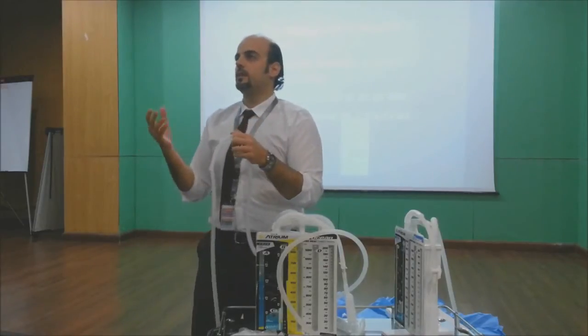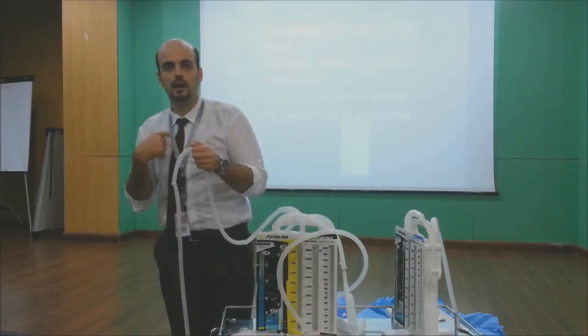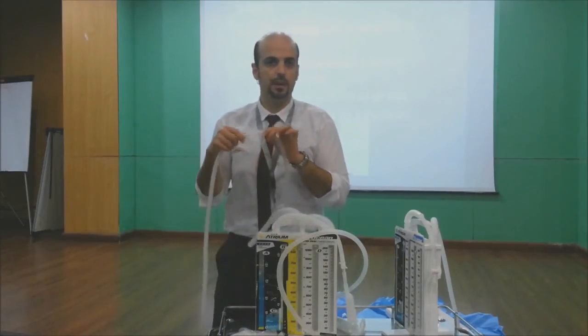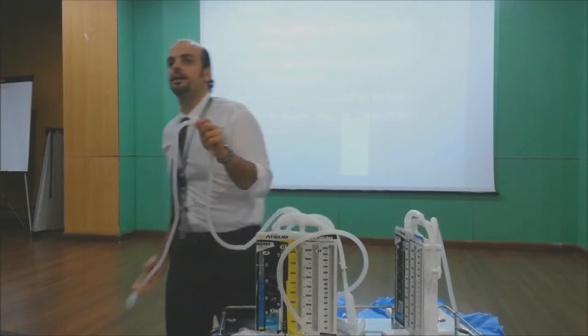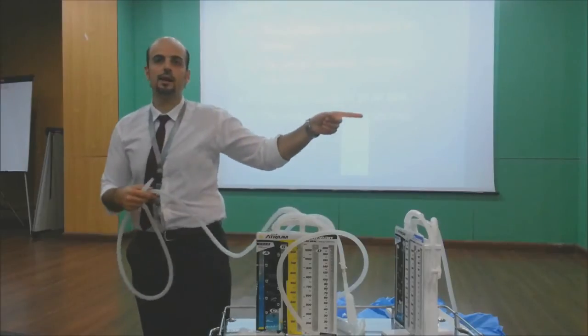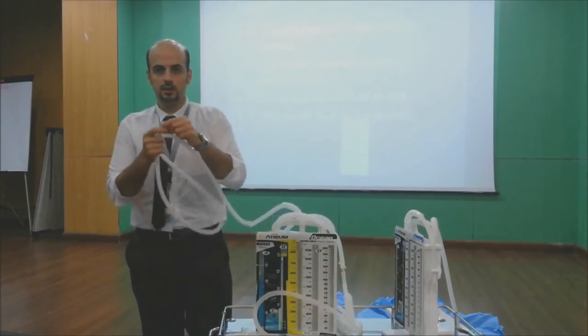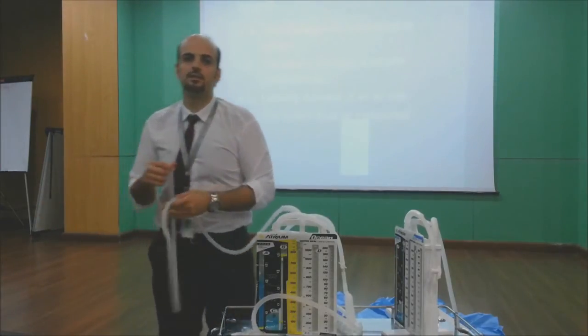But imagine this also. If I have a 1 centimeter wound in the lung and it leaks about 3 to 4 liters per minute, and the drain can handle 12. If I apply negative suction on this wound, what will happen? I will suck more and more air from the lung, so I will injure the lung more and more. So it has advantages and disadvantages.